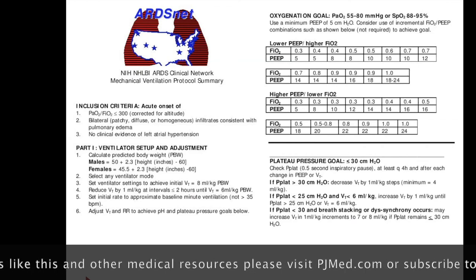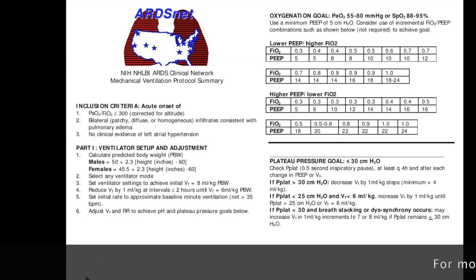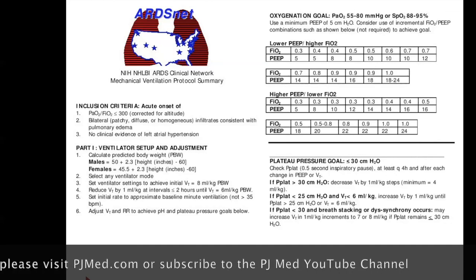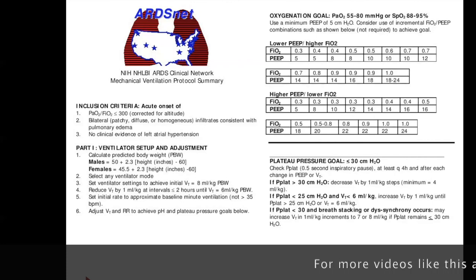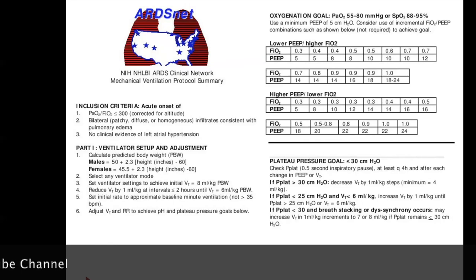But what I want to impart to you today is there are a lot of resources and cheat sheets for how to manage ARDS. And you guys, just like me, are very goal-directed. I like to be very clear with my team. Here's our plateau pressure goal. Here's our oxygen goal. We're going to use ARDSnet, and this is what we're going to do. So I'll literally print this out and talk to my team through this as kind of a crib sheet, okay? Think of it as a briefing card. That's the way we do this. I'm not going to go through this, but I just want you to know this exists. You're going to have access to it. You can Google it. This is how you manage ARDS off this one card. This is literally 75% of ARDS management right here in front of you, okay?